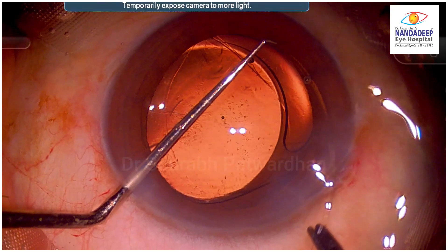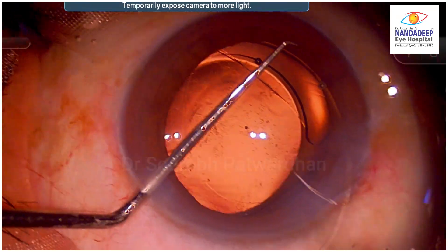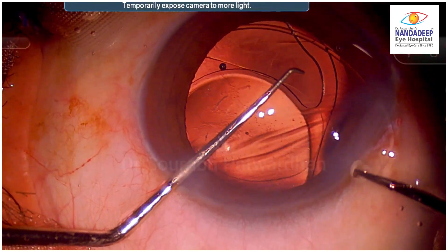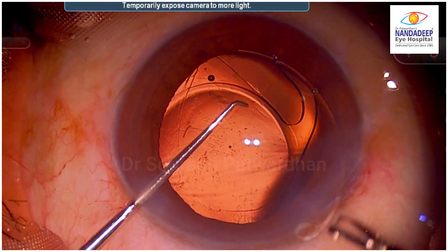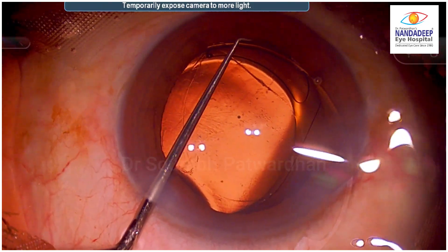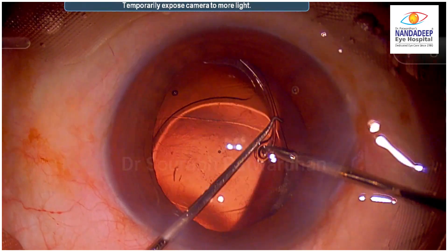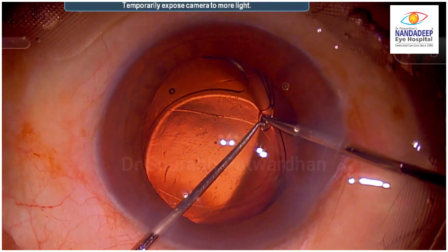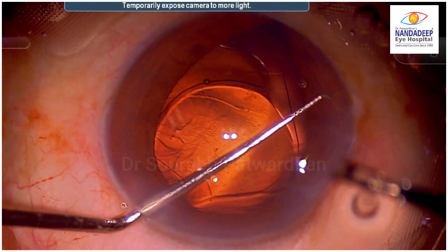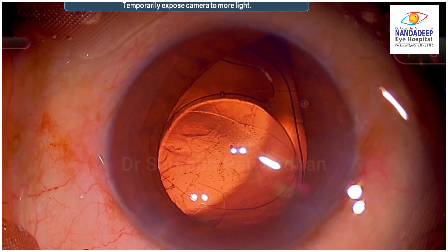The proper method should have been for the CTR to be pulled in by the Sinski dialer and then pushed in. Now watch — the micro grasper holds the eyelet and the surgeon tries to push it into the bag. But the Sinski is not pushing the CTR down and the CTR is clearly going into the sulcus. The micro grasper is holding exactly at the eyelet so the Sinski cannot hold the eyelet anymore, and the micro grasper loses hold over the CTR and it vanishes into the angle of the eye.